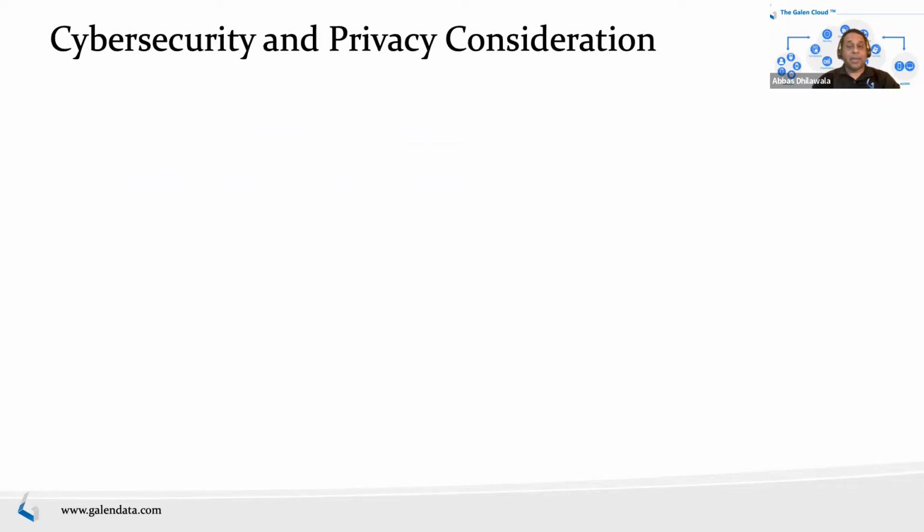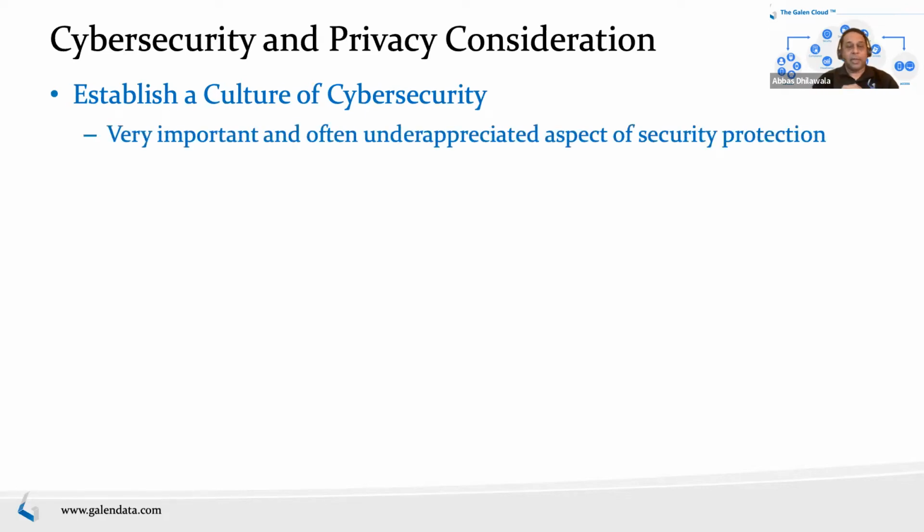So from a culture of cybersecurity, what does culture mean, right? Culture is a very important aspect, in my opinion, of cybersecurity, and it's a very underappreciated aspect of security protection. What culture means is essentially that everybody understands what their role is within cybersecurity. It's not something that only the IT people or your cybersecurity operators are worried about.